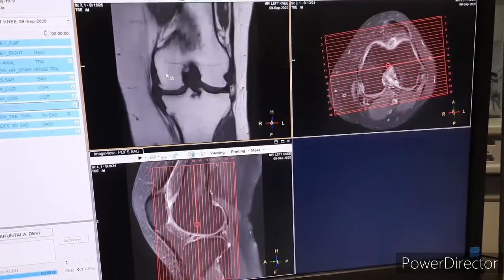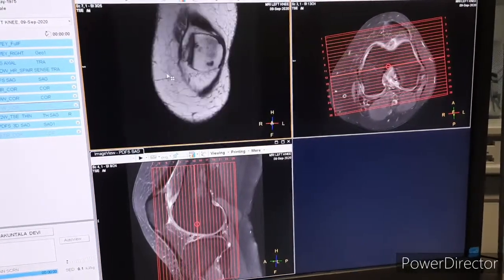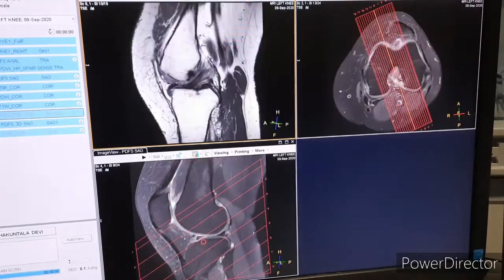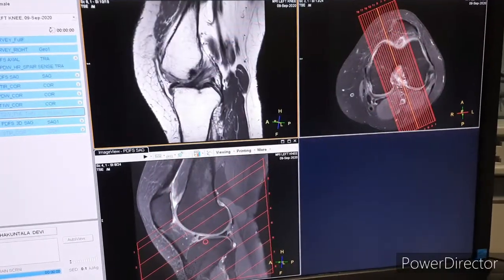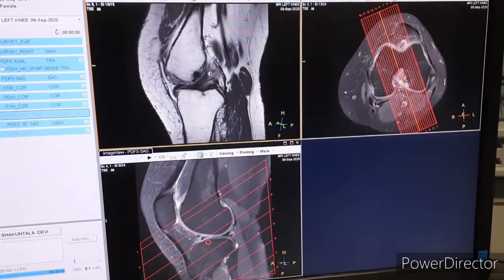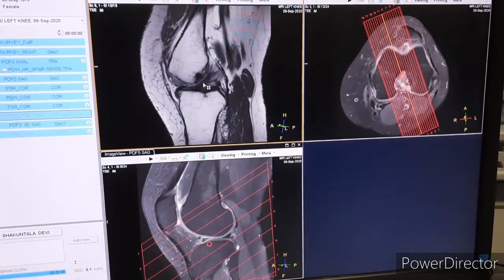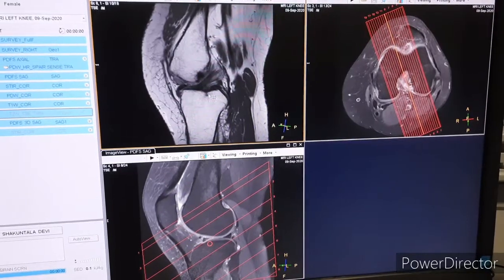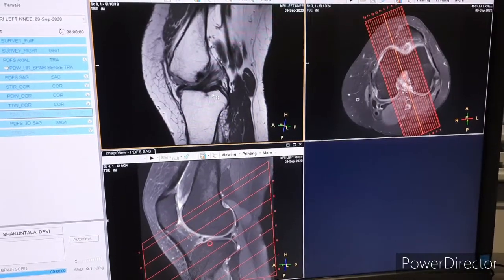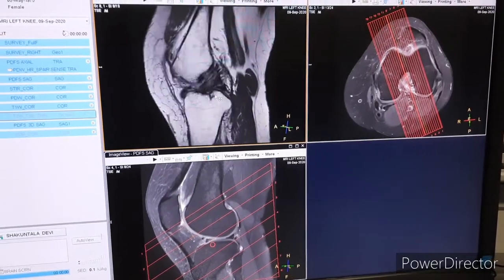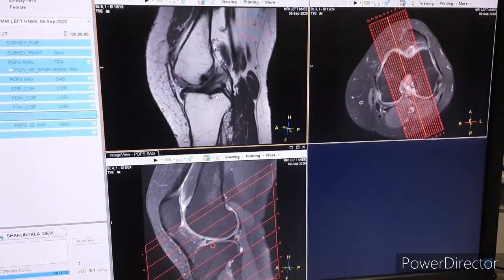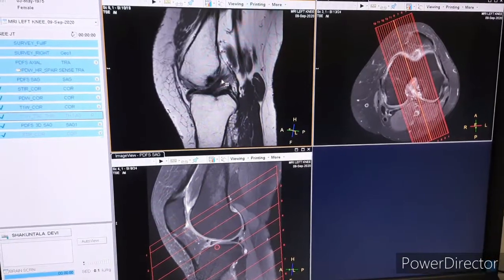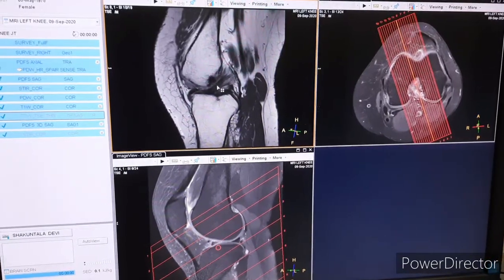This is the planning of T1-weighted coronal. Then T2-weighted oblique sagittal — this is for ACL and PCL. Basically for the ACL, you can see the ACL here properly.